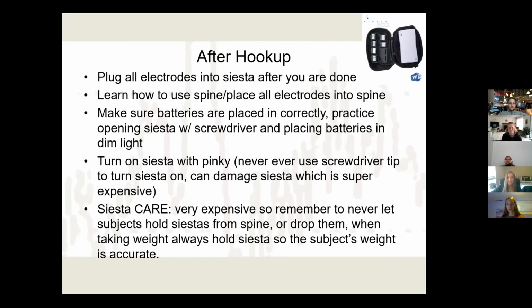Sometimes glue or the paste can get on the outer black cover. So just wipe that off with a Cavi wipe or alcohol wipes, and really just try to keep them clean, because they can get pretty nasty if you don't take care of them. And then this participant doesn't want to hold some nasty little, you know, so we just really want to make sure that we care for it as much as we can.